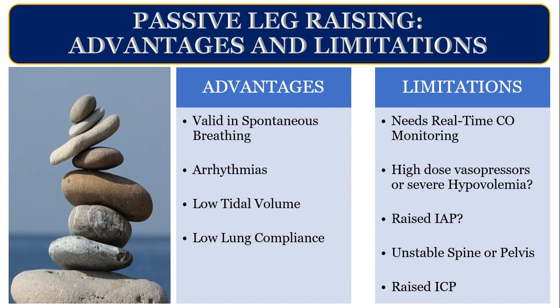But it's not all. There are different advantages and limitations of passive leg raising. First of all, advantages: it is valid in spontaneously breathing patients, as you rightly said. It is valid in arrhythmias. It is valid in low tidal volume ventilation. It is valid in low lung compliance.